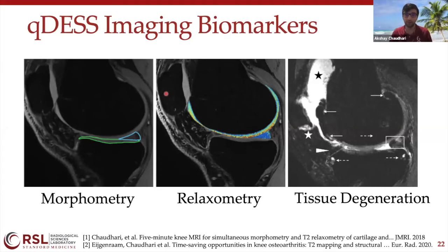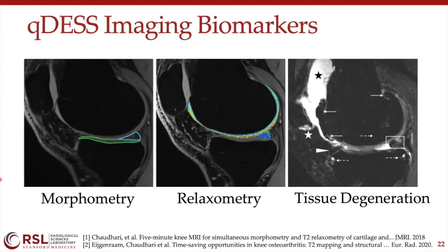From a disease-modifying drug standpoint, right now, the FDA hasn't approved any MRI-based biomarkers of osteoarthritis progression, but there have been a lot of promising studies, and everyone seems to suggest the FDA is quite close to using the thickness of cartilage as an imaging-based biomarker of different drugs, which can actually inhibit cartilage thickness loss or actually enable new cartilage growth. So I would say those are the two primary imaging-based biomarkers that we tend to use in osteoarthritis studies.